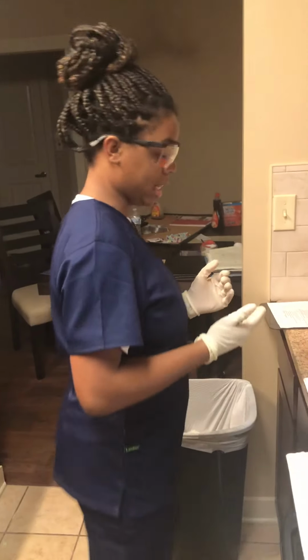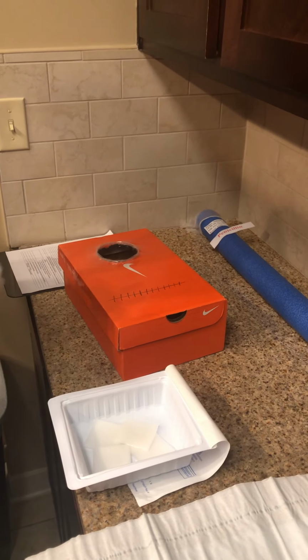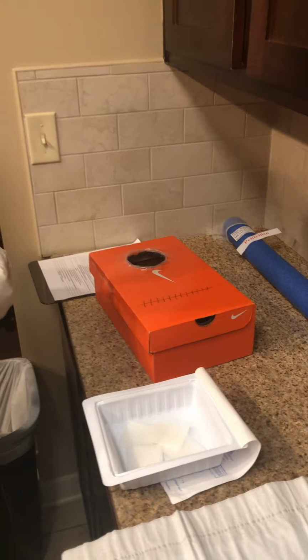Now, before cleaning my sterile wound, I am going to assess it. I'm going to assess if the edges are approximate, the size of this suture, and the drainage from the suture.